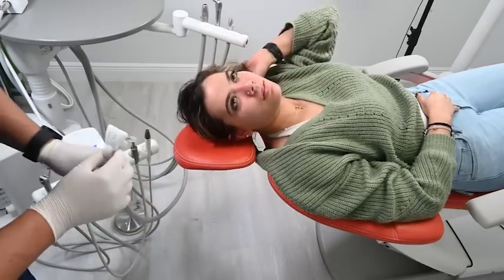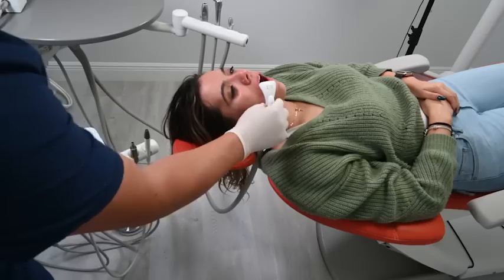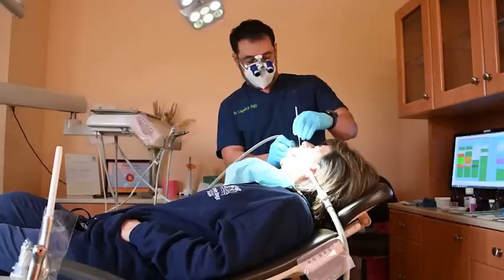When sitting the patient, it is important to have them in a supine position and make sure there is sufficient room to allow the HVE hose to fall in between the headrest and the chair. The HVE hose should be perpendicular to the floor and patient. Sitting them at a 45-degree angle can be done, but you need to make sure there is enough slack in the HVE line to not cause any additional tension in the line. It is not recommended to use the Aerosol Assist above a 45-degree position.